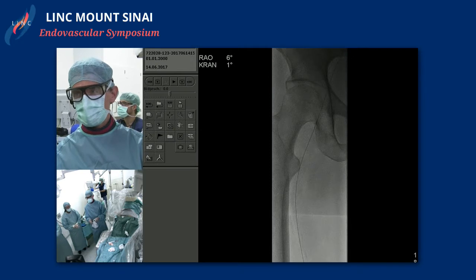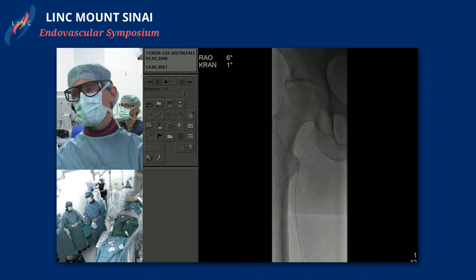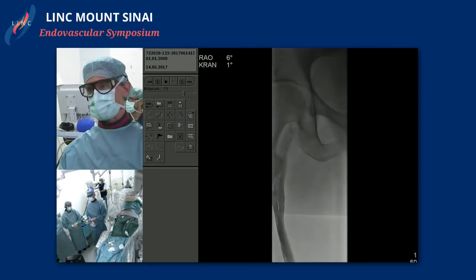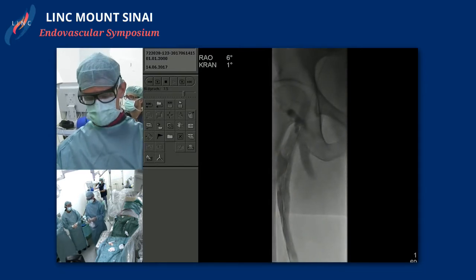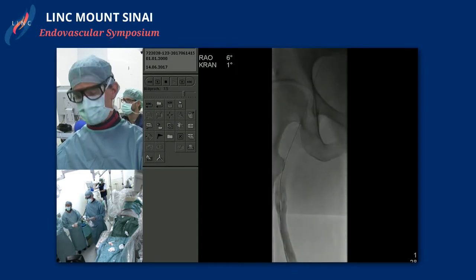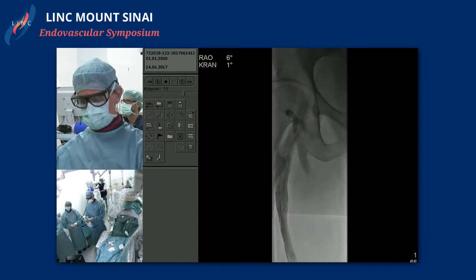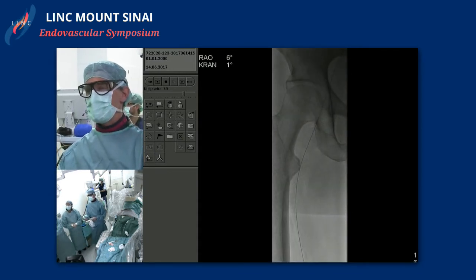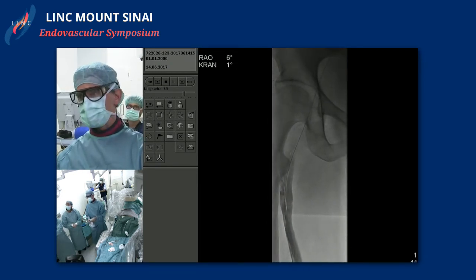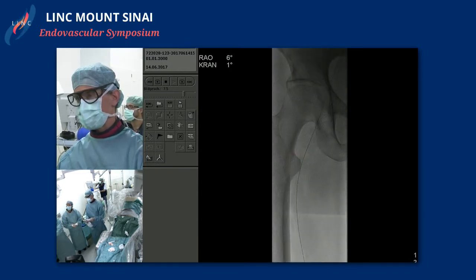Let's switch. You can see here hopefully the angiography. Of course, you may not need to do this in general anesthesia, but this lady wished this to be done in general anesthesia, and therefore you do it. Also, if the iliac is not totally occluded, it can be quite painful for the patient to balloon this. You can see here now the patient lying on the belly, the popliteal vein punctured, and maybe some residuals from the thrombosis also here in the femoral vein.